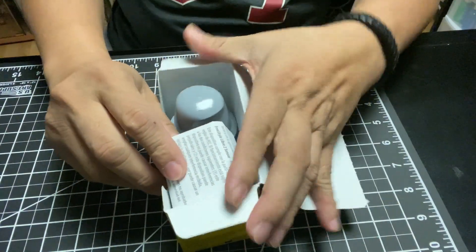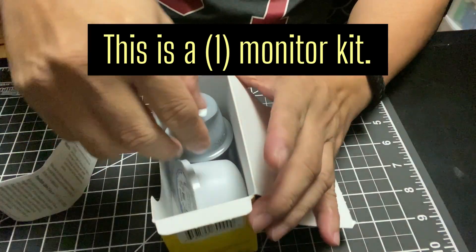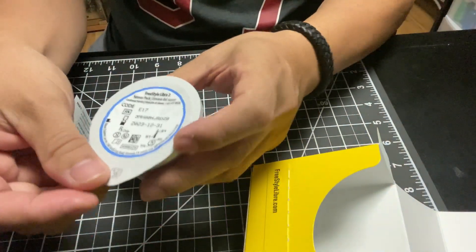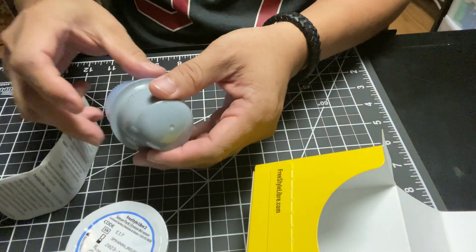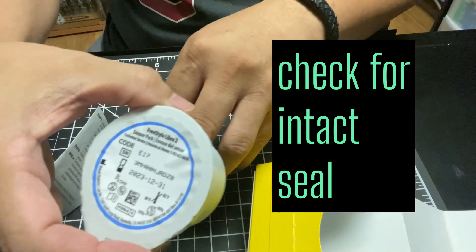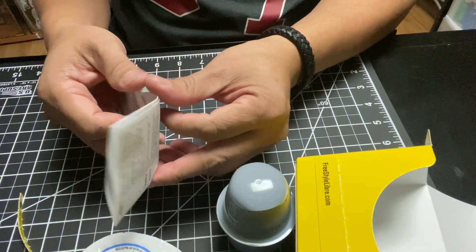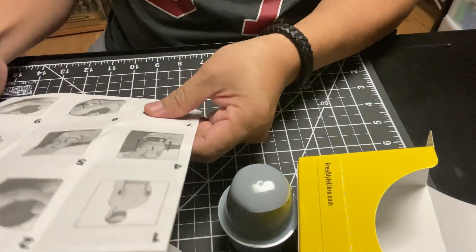This kit is for a single sensor unit. Always check the unit's expiration date. Also check for an intact seal.